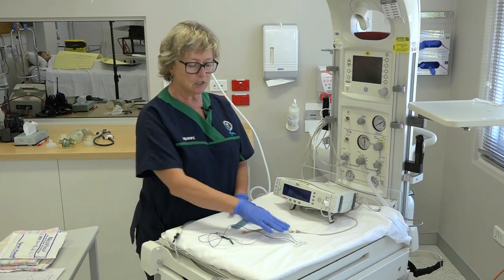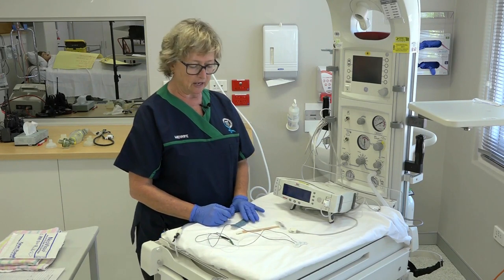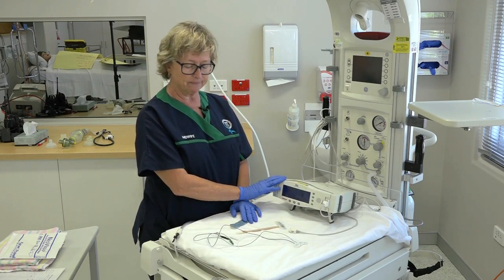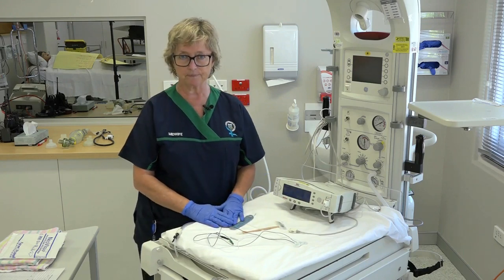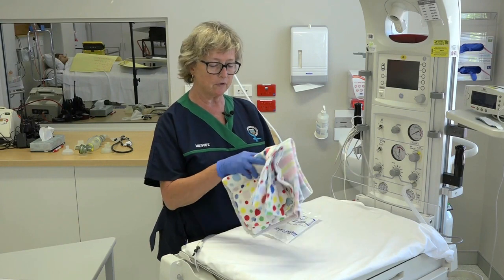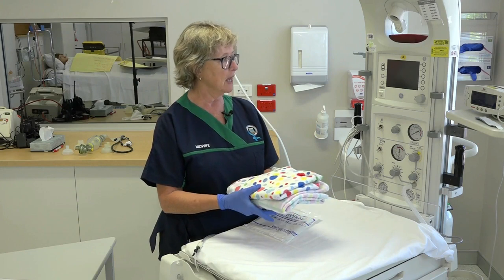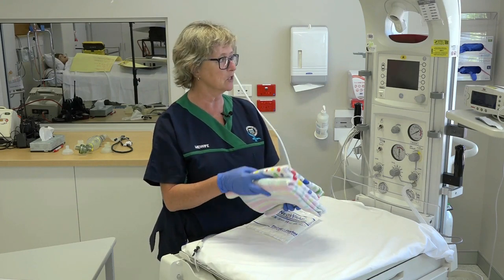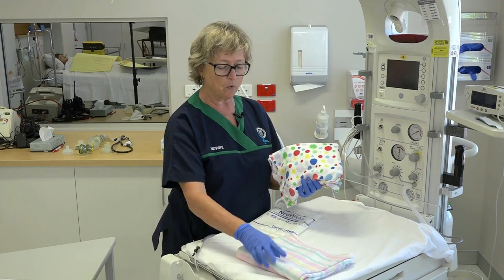It may well be that you have a three-lead ECG available, but it shouldn't be used in preference to oxygen saturation — you must always have the oxygen saturation available. It's important to keep the baby warm during resuscitation, including minimizing any drafts and perhaps keeping the baby away from a wide outside window.